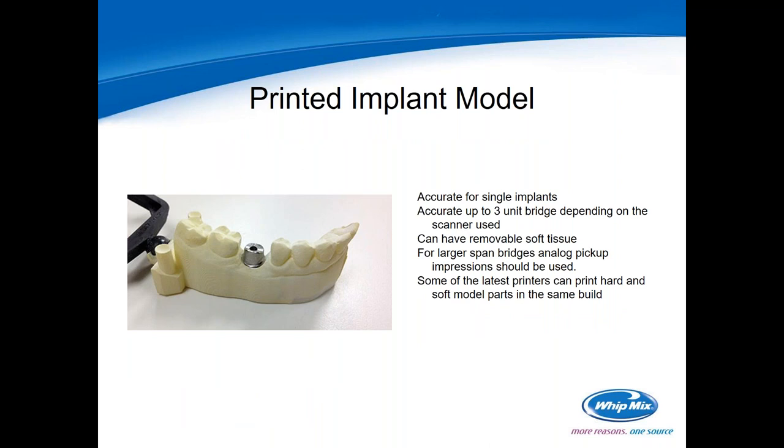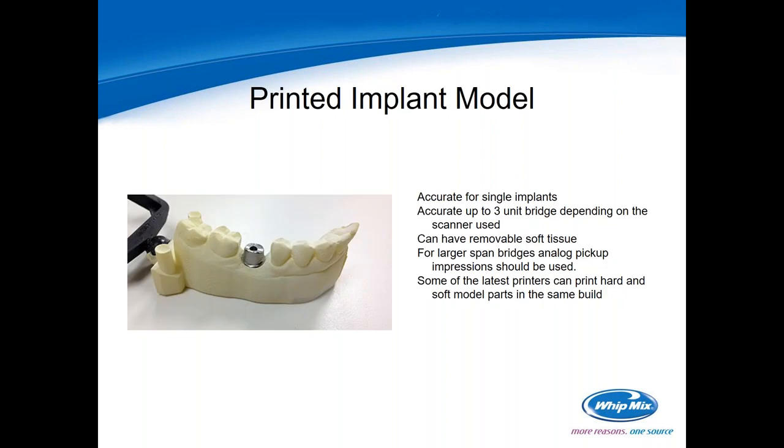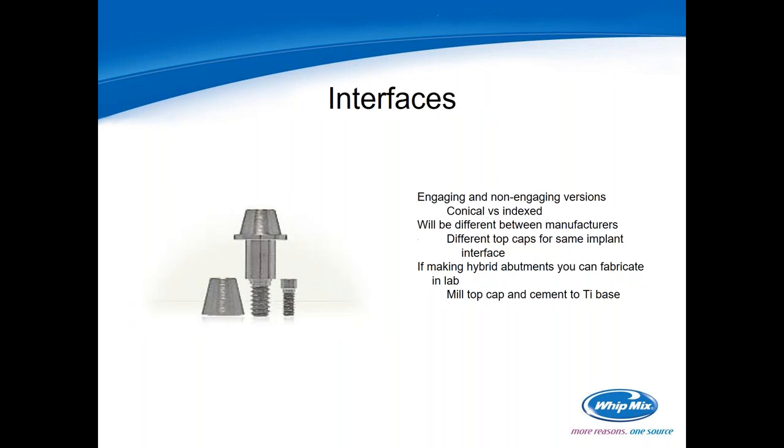If you're going to check the fit of your implants, screw retain crowns, or short span screw retain bridges, you're going to want a model. These models can be milled or printed. It's more common that they're printed. And then if you're going to do that, you also would need that 3D printed model analog. And I think I've got a slide in here I can show you of that. The next thing you're going to need is the tie base.